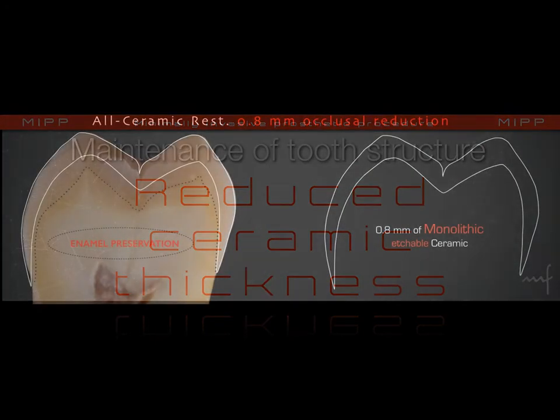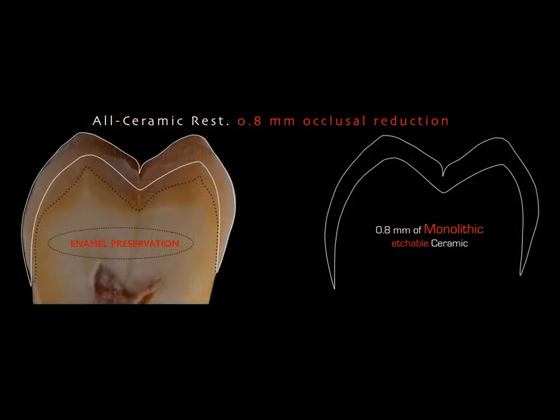Is it possible to do that? So, if you use a monolithic solution, you can really probably use an etchable ceramic. Why? Because if you have increased the vertical dimension, plus you have decreased the modality of tooth preparation, not preparing 1.5 but 0.8, at this point, automatically, we can almost avoid grinding the teeth occlusally because you have already enough space. In this case, you preserve enamel. At this point, you can bond a monolithic etchable ceramic.